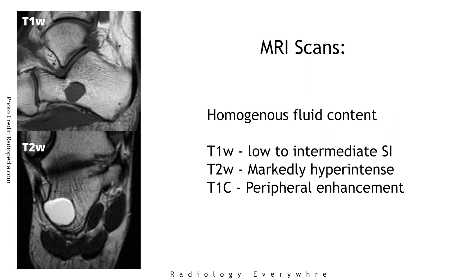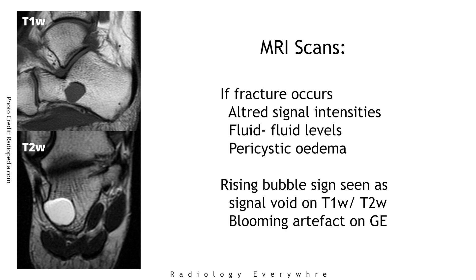MRI of the lesion demonstrates fluid content, which is homogeneous low to intermediate signal intensity on T1 and markedly hyperintense on T2. Contrast-enhanced T1 images show peripheral enhancement. This can be altered by fracture causing hemorrhage into the cyst, producing fluid-fluid levels and pericystic edema. The rising bubble sign represents a locule of gas or vacuum phenomenon in the non-dependent part, seen as signal void on T1 and T2 and as a blooming artifact on gradient echo.